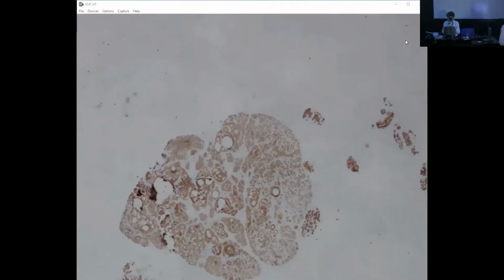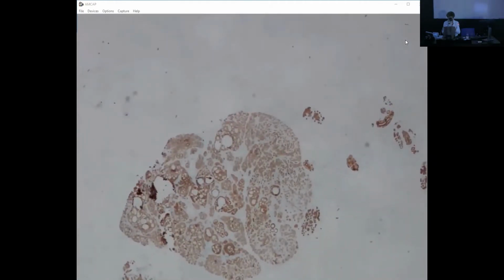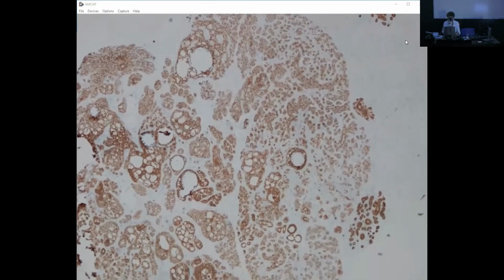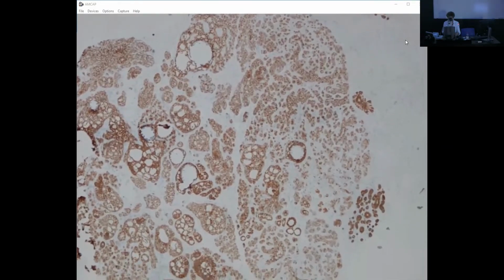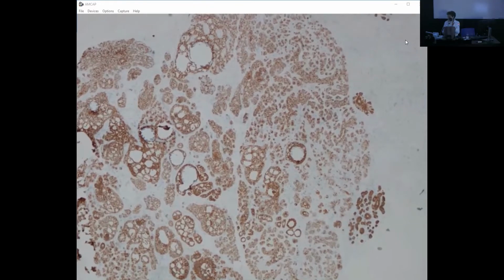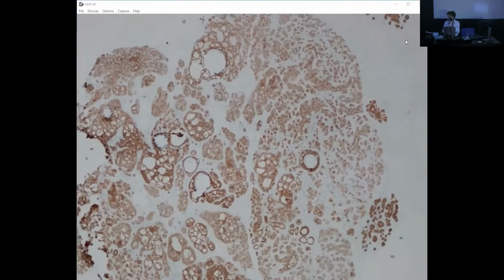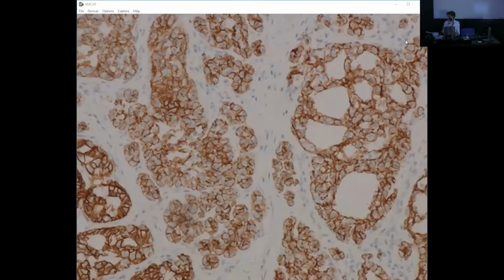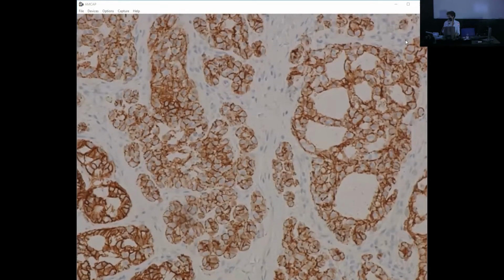This is the same area, a little bit damaged at some point. And you can see this is an E-cadherin stain, and if one is not careful, E-cadherin could be misleading in this case because there is a lot of positivity, as we discussed already, and even in this area, it seems to almost highlight the cell membrane of these cells, right?